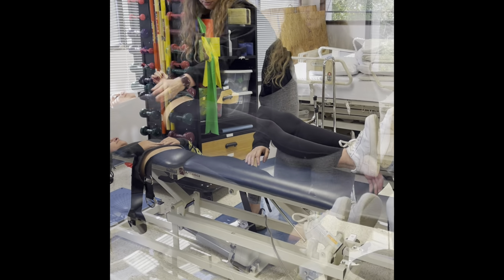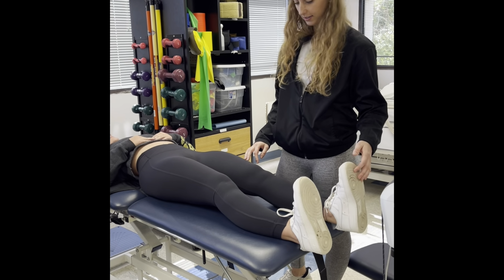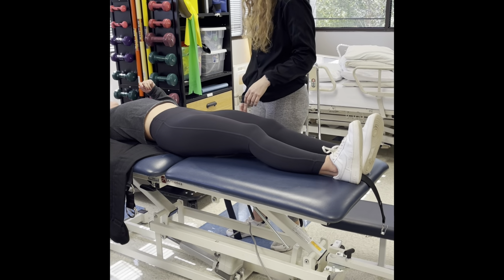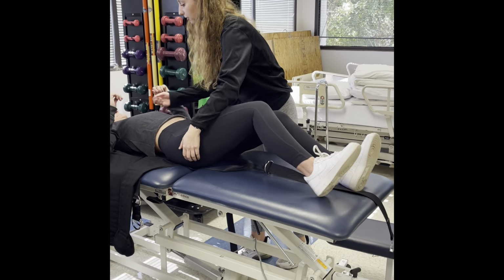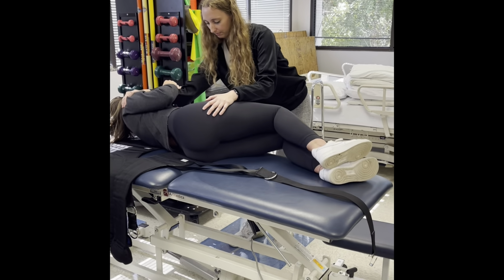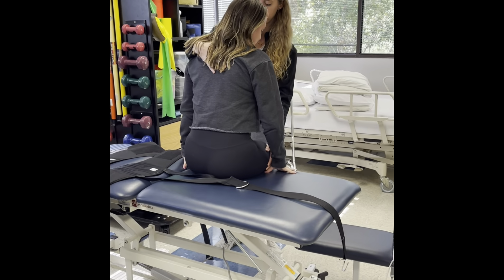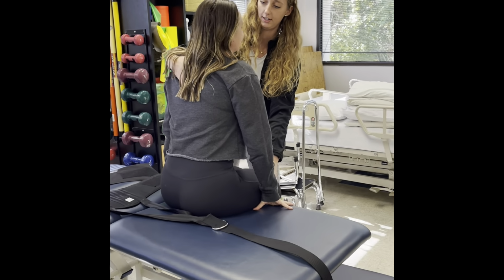Then you're going to have the patient do some ankle pumps for us, to get the blood flowing. You want to try to keep their back as straight as possible. So I'll have you go ahead and roll over to your side, and then I'll lift it up just like that. How are you feeling? Feel okay? All right.